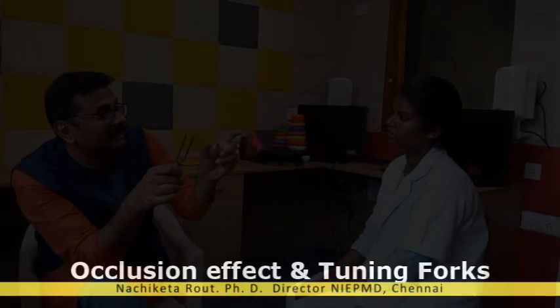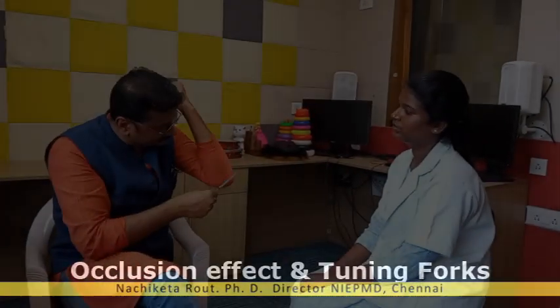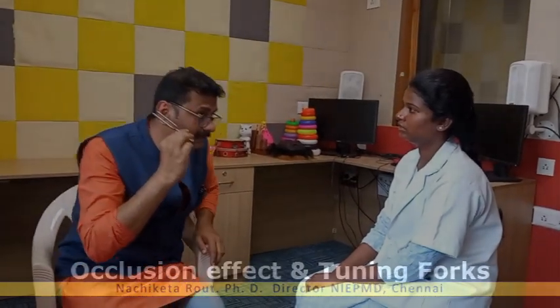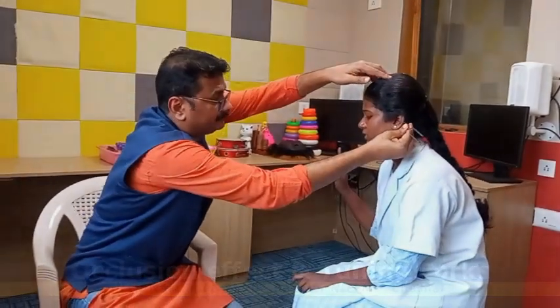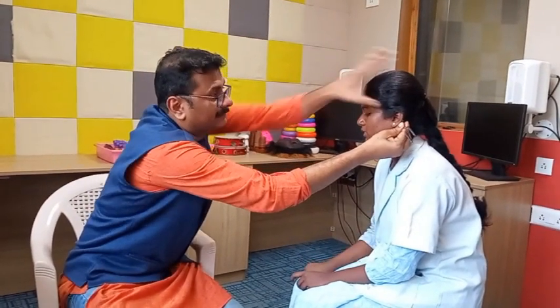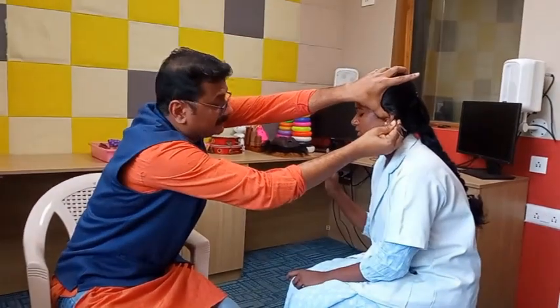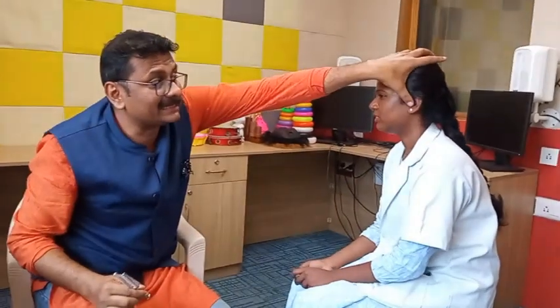As the occlusion effect, correct? What happens is that I hit the tuning fork, I hear — I put it to the bone conduction, she is hearing it. As she stops hearing, I close it, she again starts hearing. That means, as I close her ears, her audibility increases.